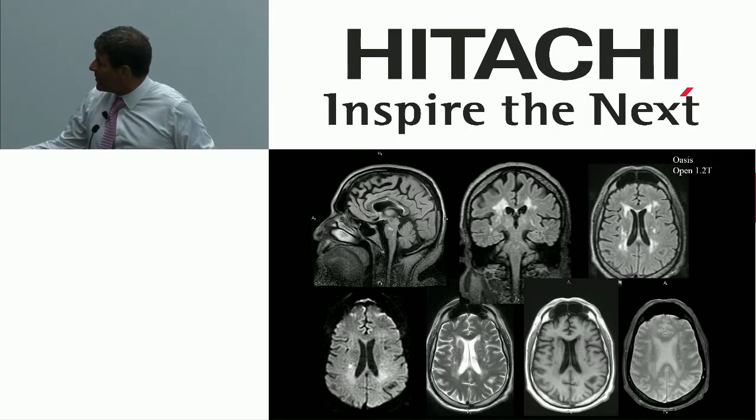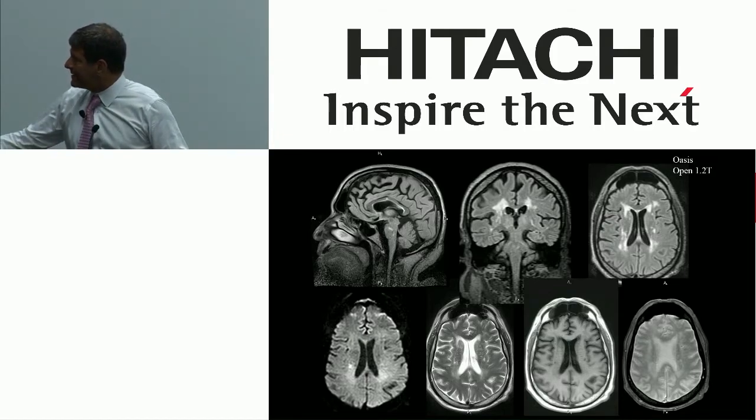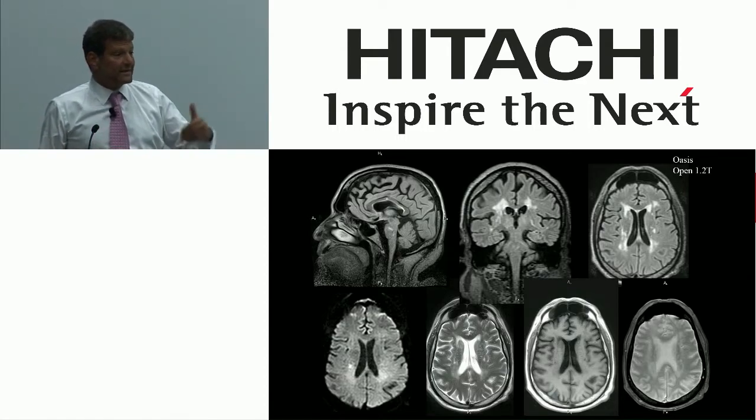Here you see all three of these FLAIRs, all from one acquisition. You can see that this is a big boy high field scanner. It does a beautiful job with diffusion. There's a little acute lacunar infarction right here. All the little things you'd like to see, but frankly, the innovation here is shifting to 3D. We have practices that want a sagittal and an axial. In those practices, we go 3D.